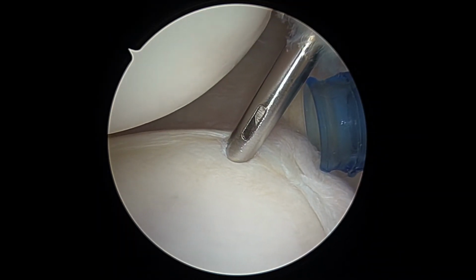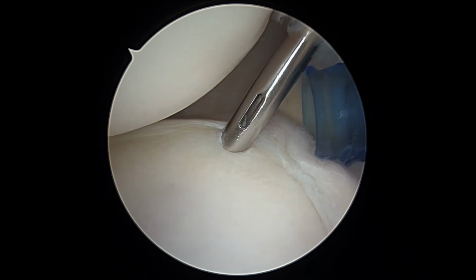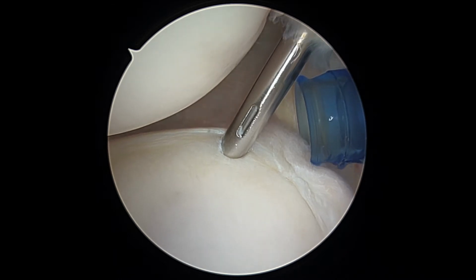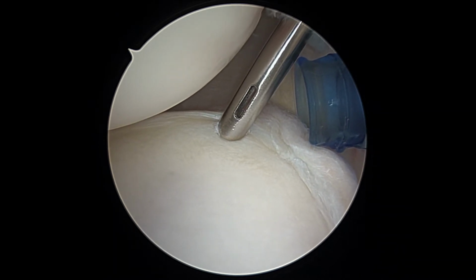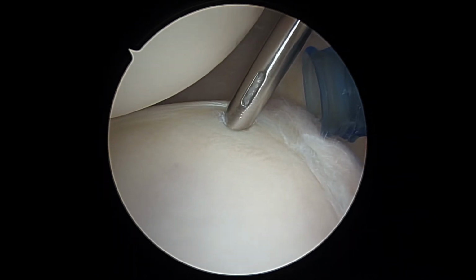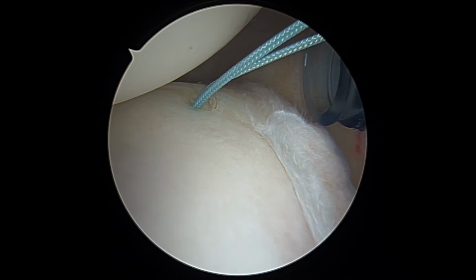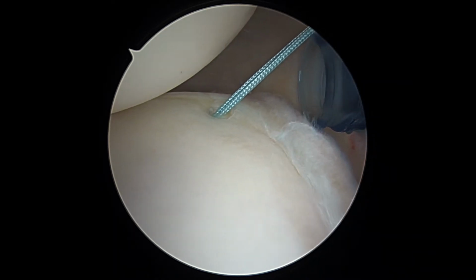So next we'll take our scalpel and we'll show you some more in just a minute. Okay, so here is our drill guide. Next step is we're going to drill, and then after that we mallet down the suture anchor. So if you look very carefully, you'll see a little thin wire that functions as our drill. And now that we've drilled a hole, we can take our suture anchor, place it in, tap it down by hand for a second, and then we just take a mallet to complete the insertion. And this anchor just bottoms out at the guide, and then we pull back on it, pull out the inserter, or the guide, I should say. And now that gives us two strong sutures to work with. We have to seat the anchor by pulling back on both sutures, and now that's seated.